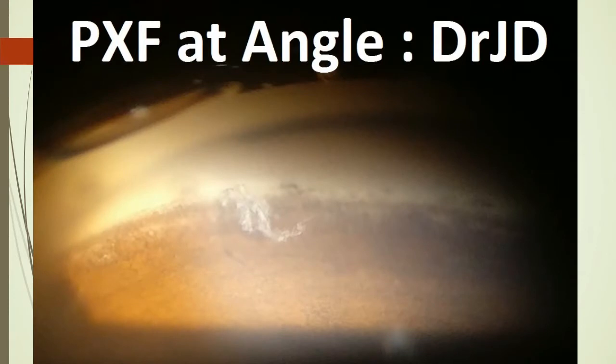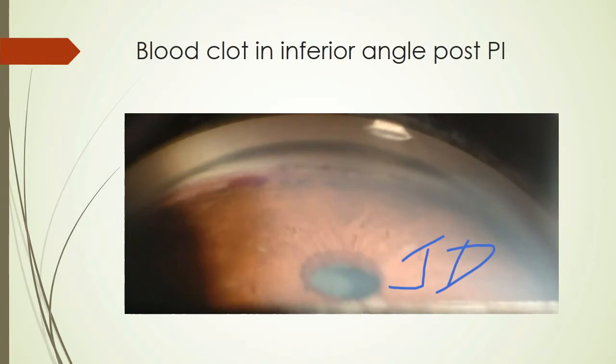This gonioscopic photograph shows pseudo exfoliation in the inferior angle. This was taken with the same smartphone and slit lamp. This gonioscopic picture shows a blood clot in the inferior angle following a YAG PI.